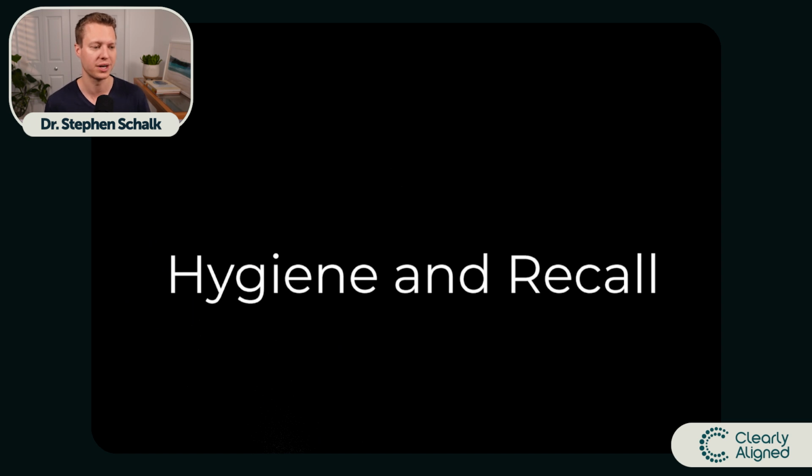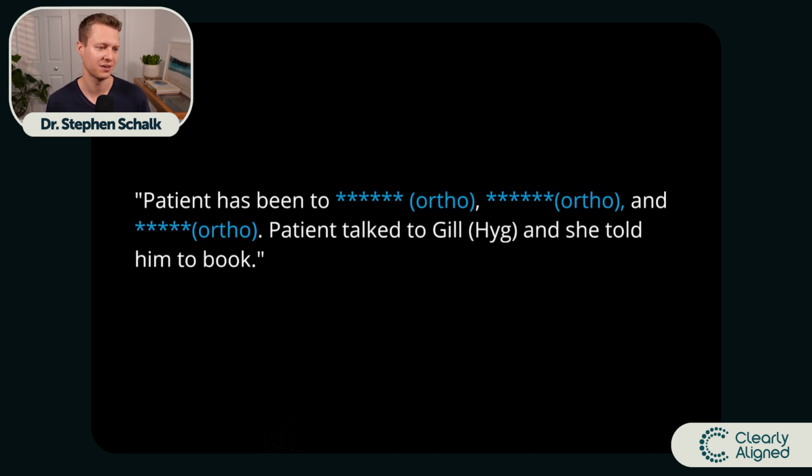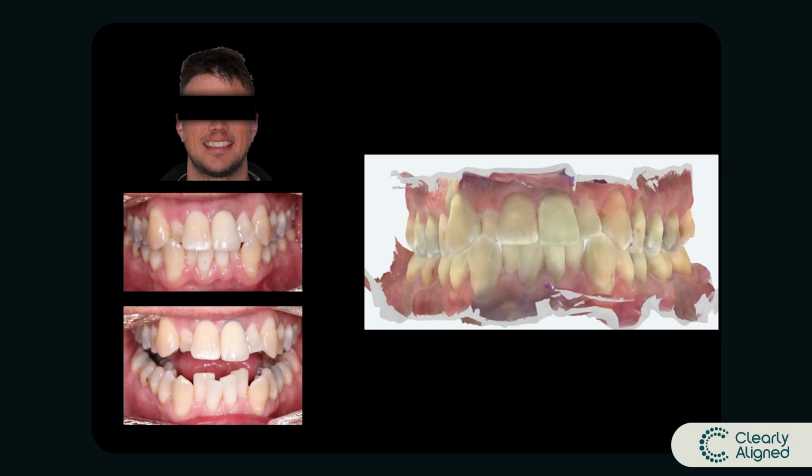So the first time we encounter this patient is when he comes in for a cleaning. He was told by every orthodontist in our city that he was not a candidate for orthodontic treatment. And so to me, when I hear that, I just say, challenge accepted. So my recommendation to all of you guys is going to be to take scans of the patient in the hygiene chair. Now this patient, he knows that he would benefit from orthodontic treatment.